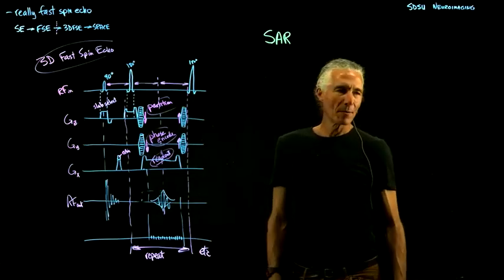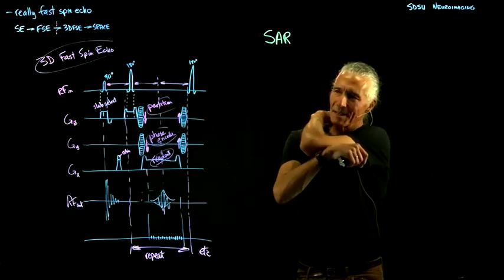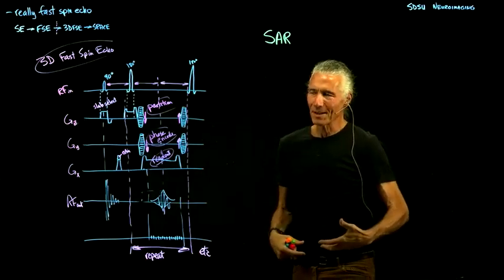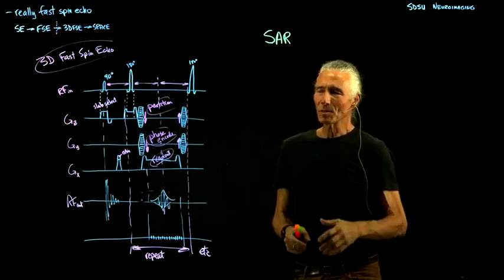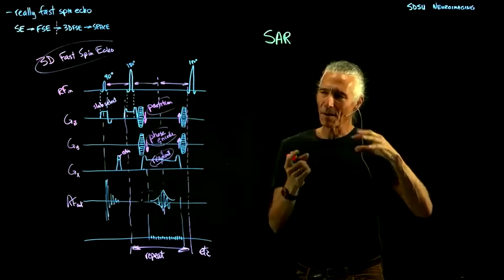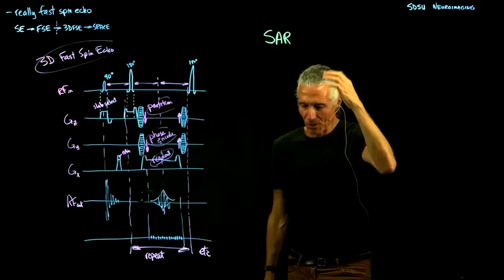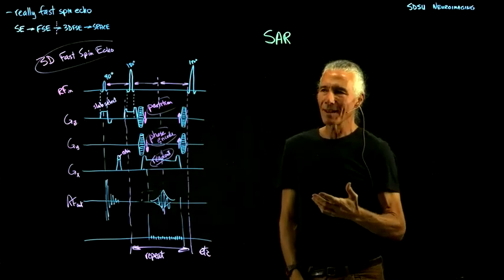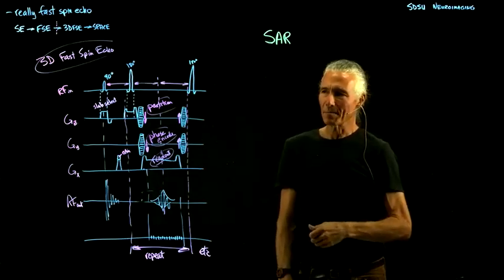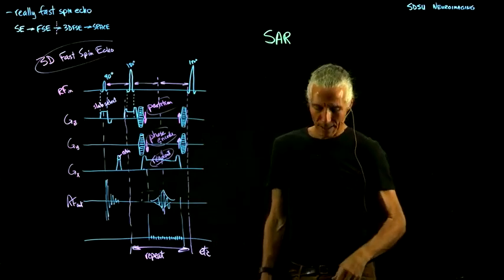But all the RF power doesn't get absorbed, because you're not a very good antenna. You don't have a lot of metal in you, and if you stick some metal in the microwave, more energy gets into it. So we're not a very good antenna, and most of the RF is still sloshing around. RF are radio waves that can propagate through a vacuum. So you just measure how much RF was left after we ran the RF pulse, and you can tell from that how much went into the body. You carefully measure that all the time to make sure that it doesn't get too high.